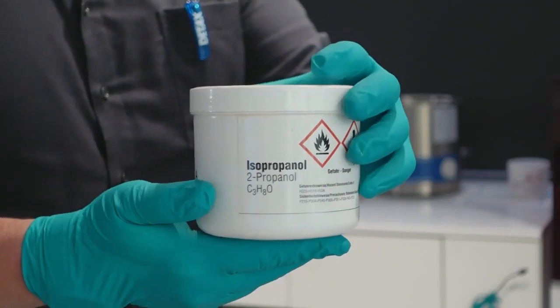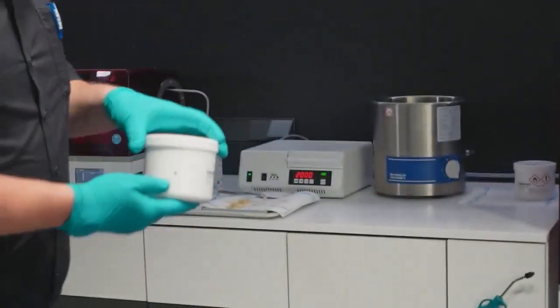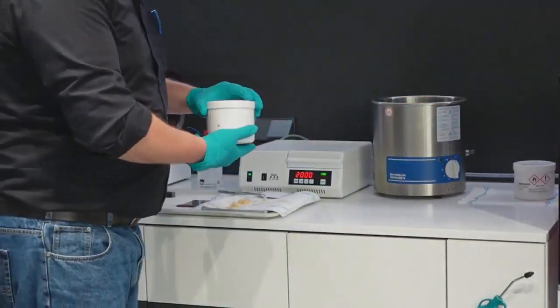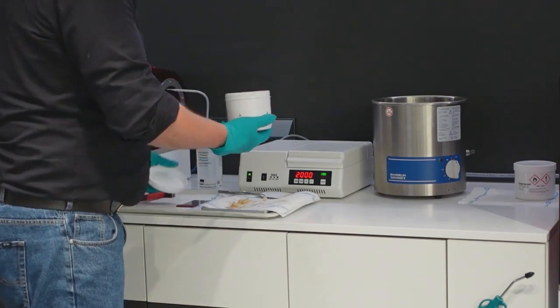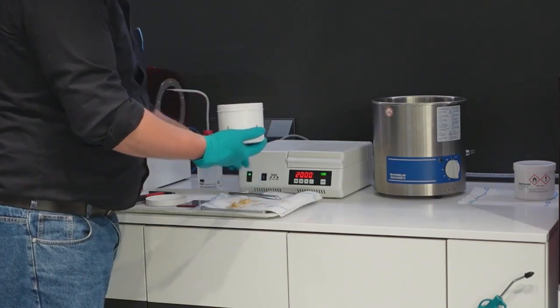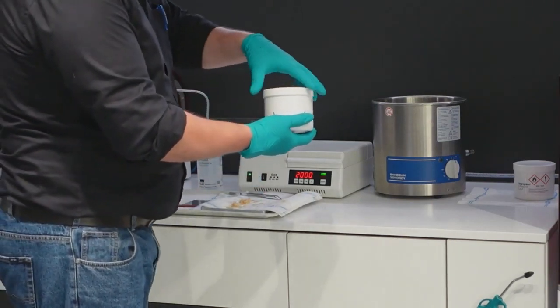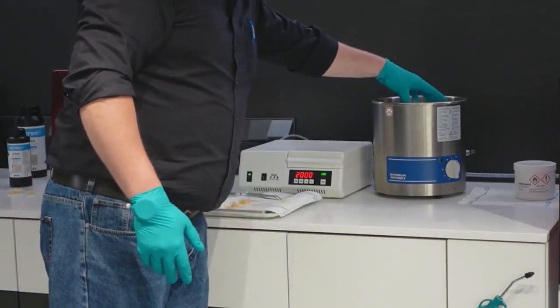Yes. And it is marked with A and also with a name. And we have another one marked with B, so that we know, okay, this one is our isopropanol alcohol for the first cleaning step. That means we take the material inside. After blowing the rest of the liquid material away, close it, take it to the ultrasonic bath.